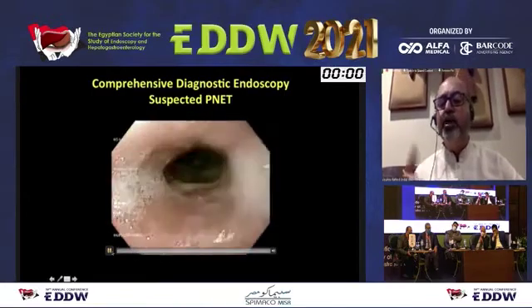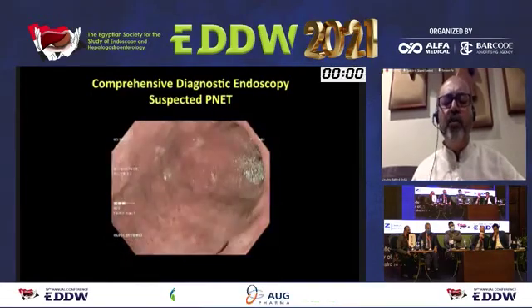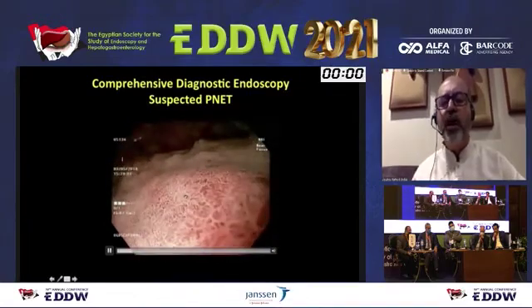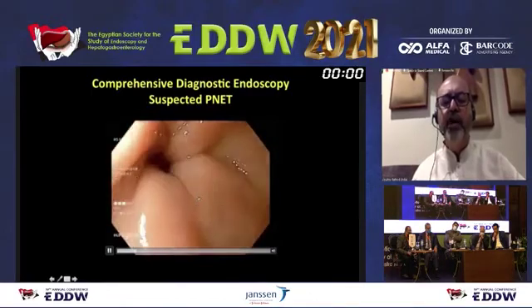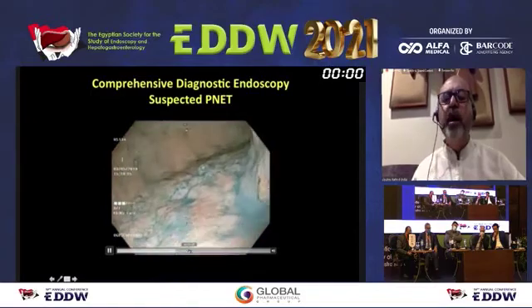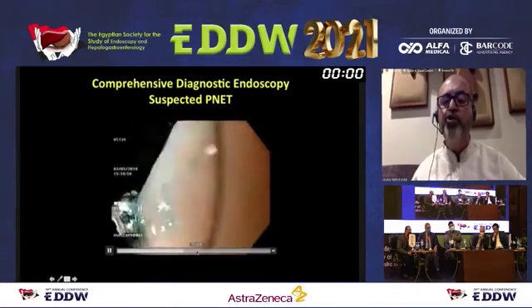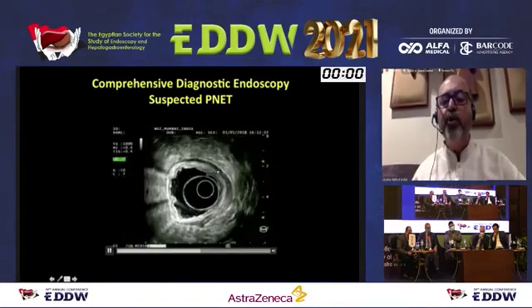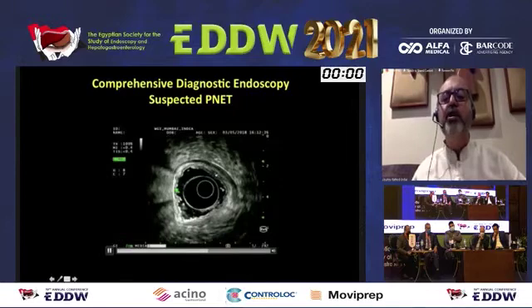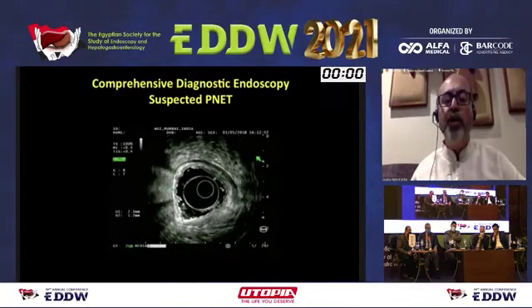Coming to the contrast enhanced EUS, which I mentioned, I had this patient referred, an 80-year-old lady who was having a suspicion of some kind of neuroendocrine pathology. Her stomach on high resolution endoscopy was showing very, very funny images. So that was not very important. We took some biopsy, we did chromoendoscopy, and she had neuroendocrine pathology of the stomach as well as the pancreas. So when I did endoscopic ultrasound for this patient, you will see hypoechoic diffuse thickening up to the submucosal layer you can see here. And when we did contrast enhanced EUS, we picked up an incidental pancreatic neuroendocrine tumor on EUS.